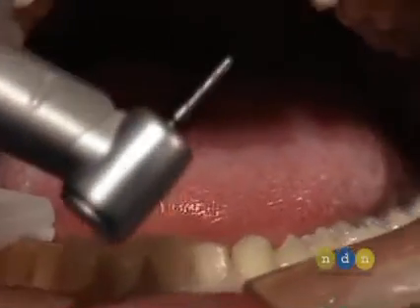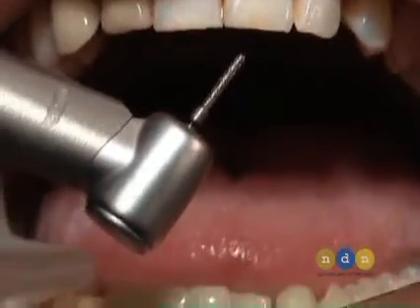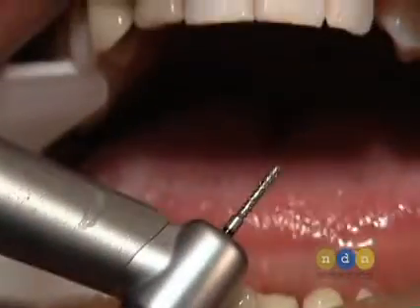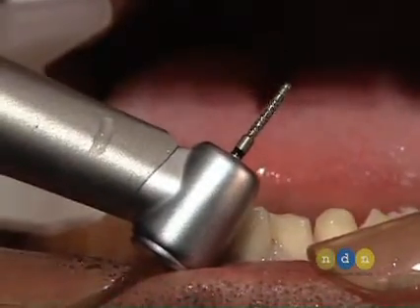Now I'm going to use this little KS-1 diamond burr, which has a little rounded end on it — a rounded shoulder — to prepare over the occlusal, the incisal edges of the mandibular premolars.